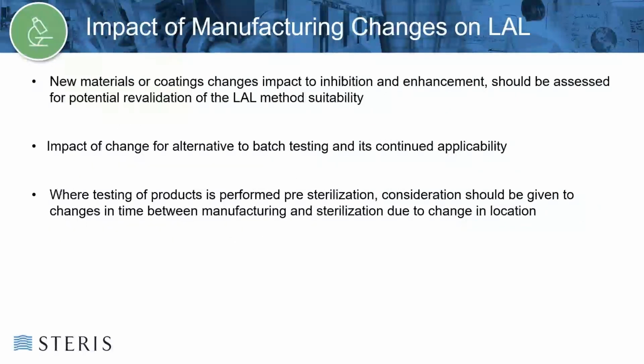For changes such as new materials or coatings, the impact from product-related inhibition and enhancement should be assessed along with the need for revalidation of the LAL method suitability. ISO 11737-3, Section 9.2.2 requires reassessment of the impact of changes to the test method.